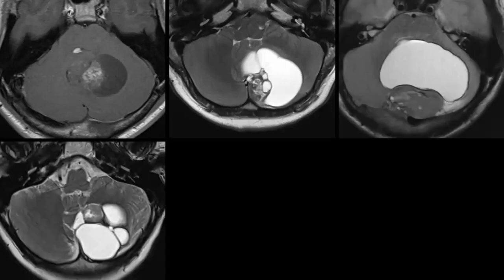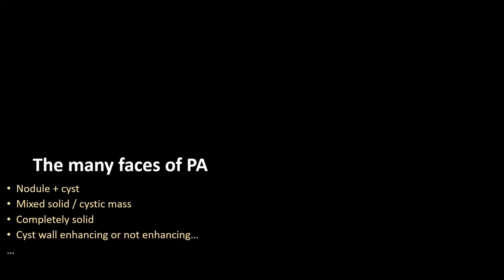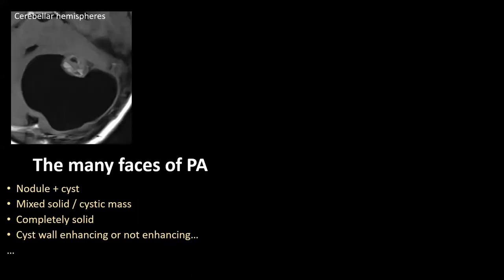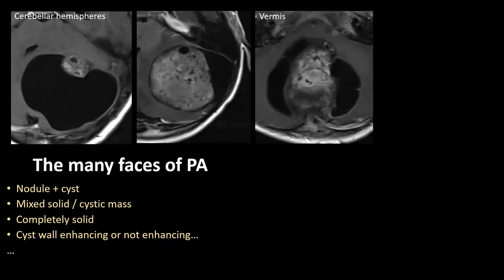These are all pilocytic astrocytomas, and each one has this classic appearance — but with some variability. We can each time see a large cyst and a nodular component that is enhancing. The cyst wall may or may not enhance. The appearance can be more heterogeneous than just the cyst-with-nodule pattern. Some tumors are mainly solid with a smaller cystic component; others are predominantly solid with no surrounding cysts; and some present as a completely solid mass with hyperintense T2-weighted signal and little or no enhancement.